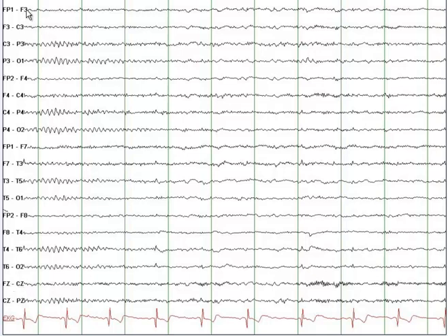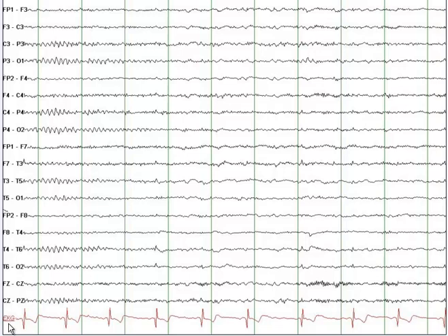So here you are recording from the left frontal, central, parietal, and occipital region. Then you are recording from the right frontal, central, parietal, and occipital region, and likewise the left temporal occipital and right temporal occipital region. At the bottom of this EEG, we also have an ECG.